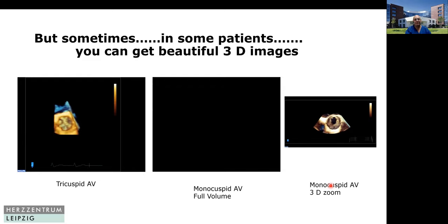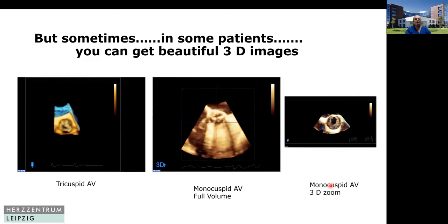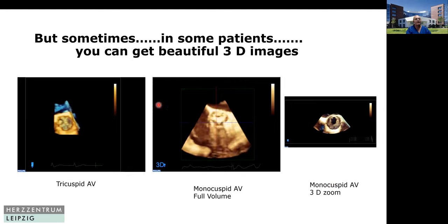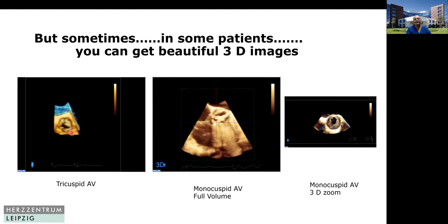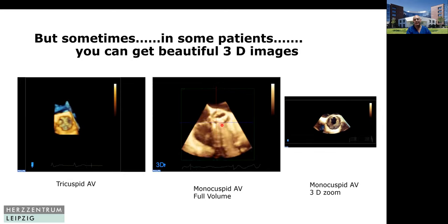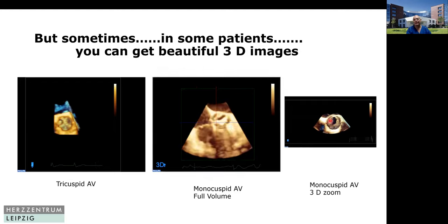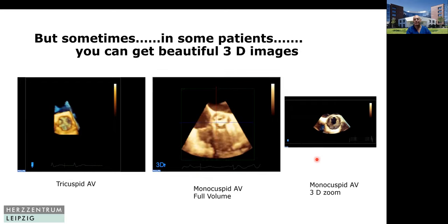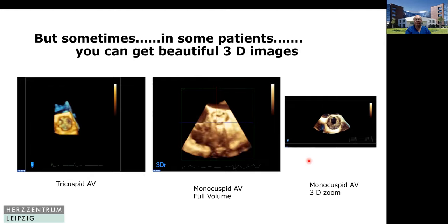But sometimes, in some patients, you can get beautiful 3D images. For example, a 3D tricuspid aortic valve here — this is an image of a monocuspid aortic valve in the full volume, and here it's a still frame in the zoom. So you can get beautiful images sometimes.